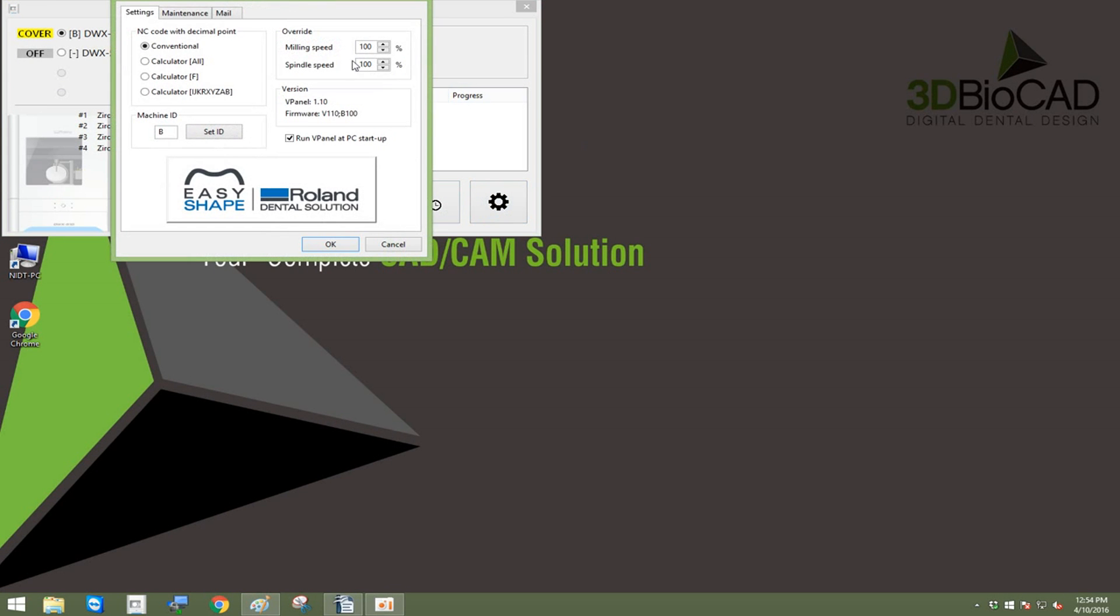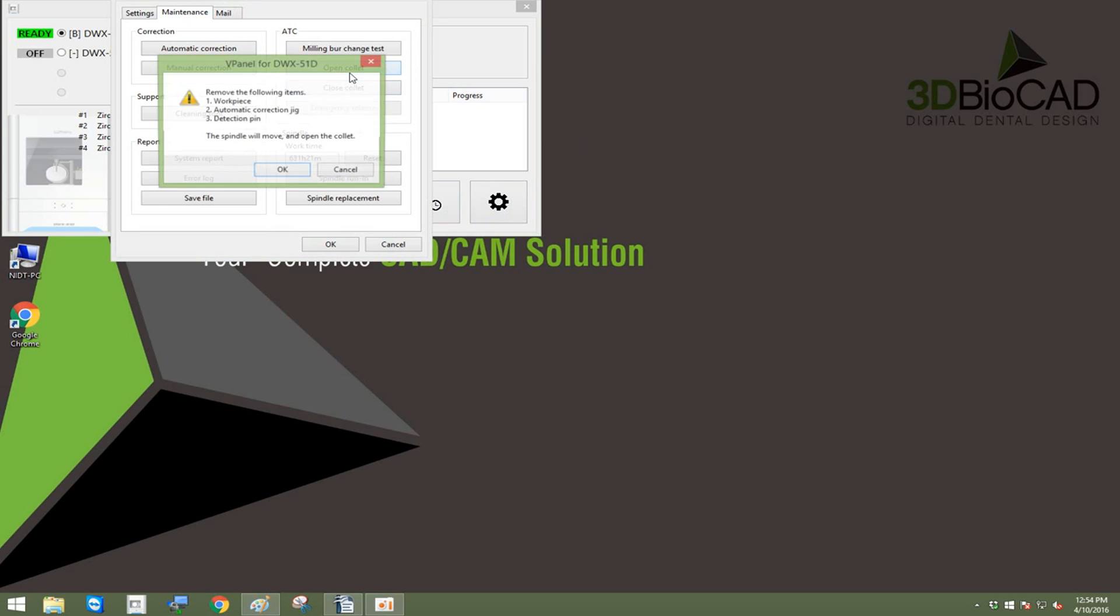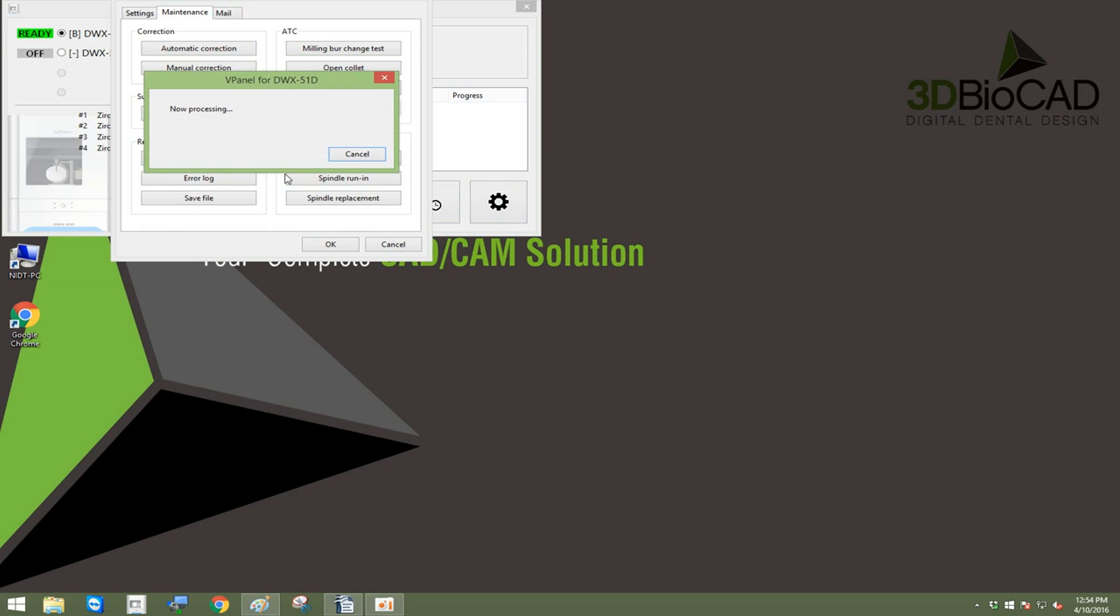First click on the gear to open settings, then click on open collet. This will allow you to insert the correction pin. Read the instructions carefully and follow before clicking OK.